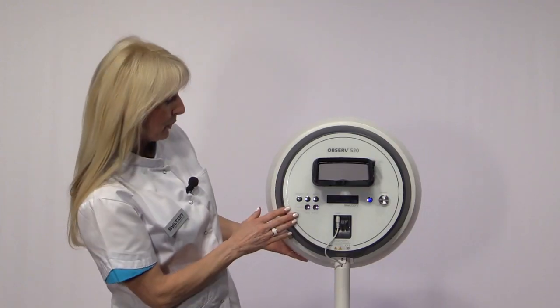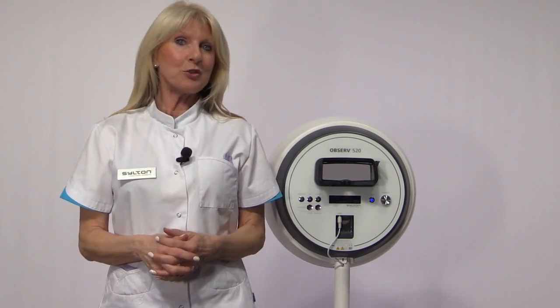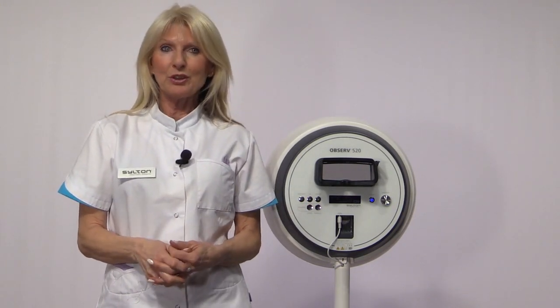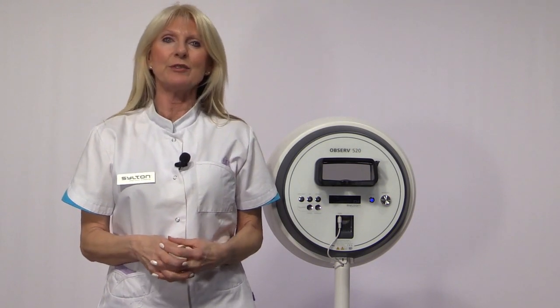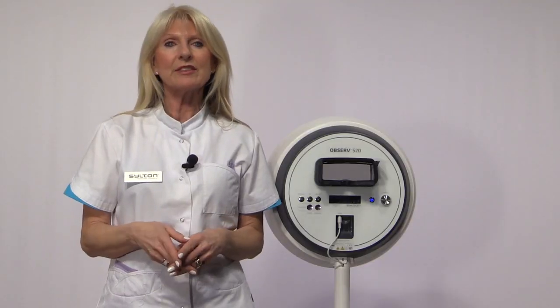Now for the UV mode, which is this one here. The UV mode is a kind of special mode, because in this mode the 6 emitters generate invisible but harmless UV rays. This UV light is turned into visible fluorescence when absorbed by the skin. Basically, the light you are seeing is not light reflecting from the skin, but light which is generated by the skin. Effectively, the skin itself is turned into a lamp.